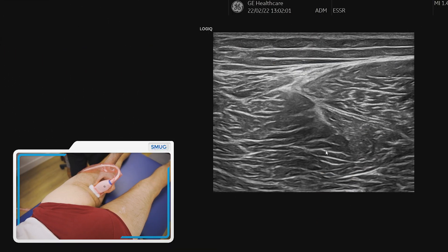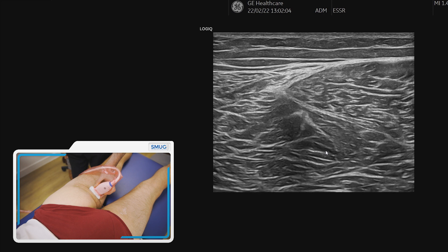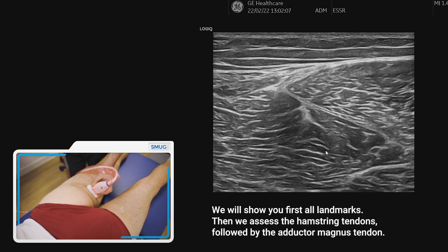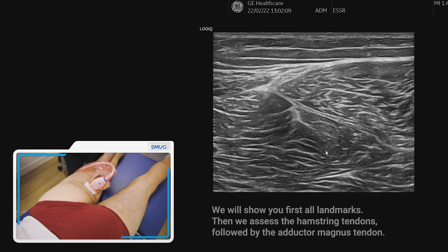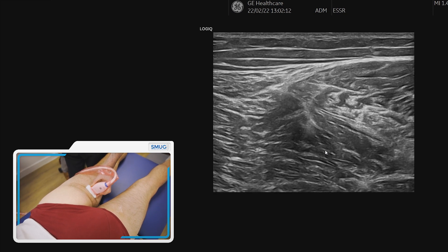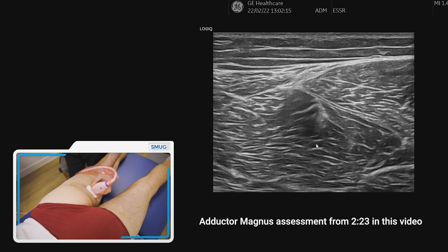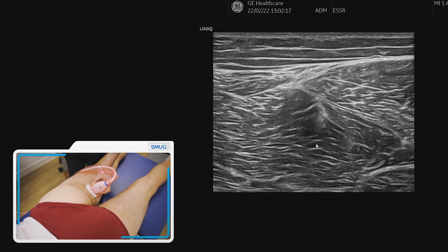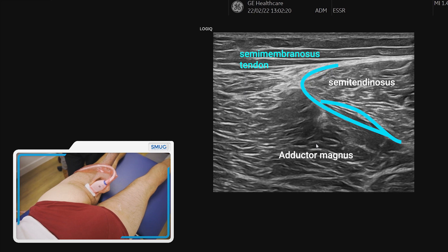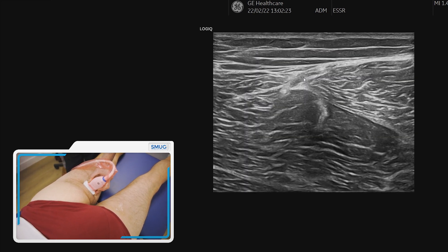Let's take you through the adductor magnus tendon approach to its insertion, but before we do that let's look at the landmarks for the proximal hamstring. We start on the medial side and identify the big adductor magnus muscle and the edge on the medial side of the semimembranosus and semitendinosus.